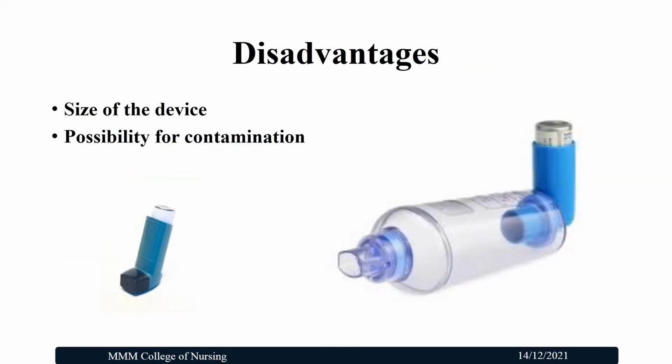The disadvantage in using the chamber is that the chamber size is bigger, so it will not be very comfortable to carry all the time, and there is a possibility of bacterial contamination.